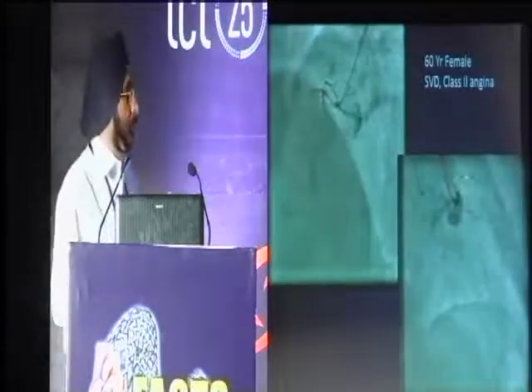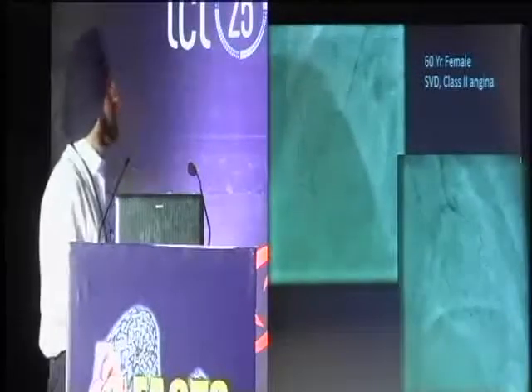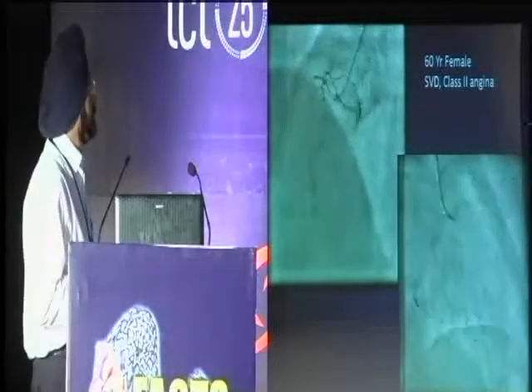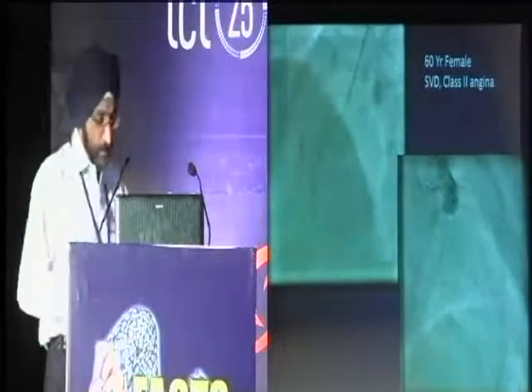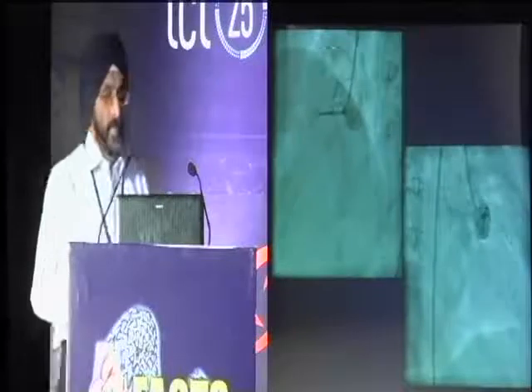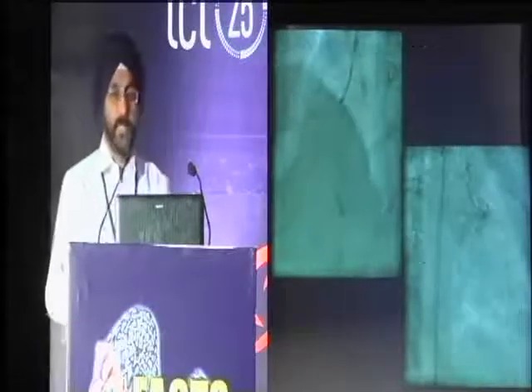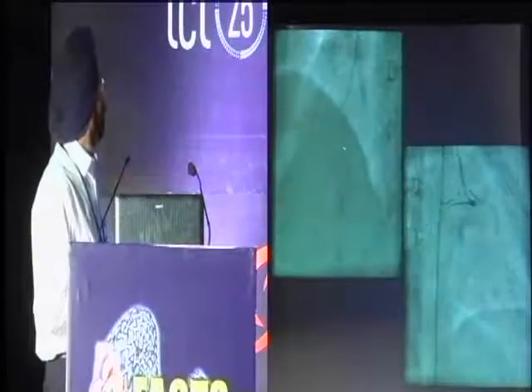There are 3 cases, and this is the first case, a complex CTO. You can see a single vessel disease in a 60-year-old female, with a lot of bridging collaterals, but the important point was that there was a small micro channel. So initially a Fielder wire was tried. Somehow it could not be negotiated across the stenosis. So what we did was we took a Cross wire NT. This is a polymer jacket hydrophilic wire for CTO.